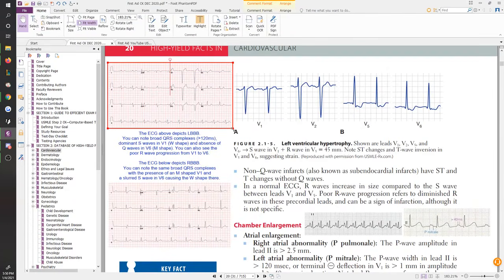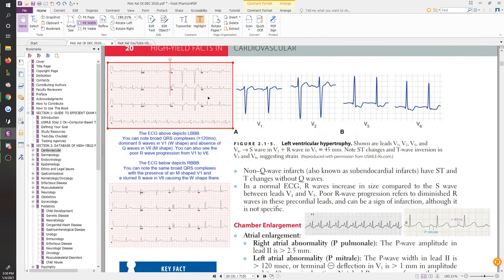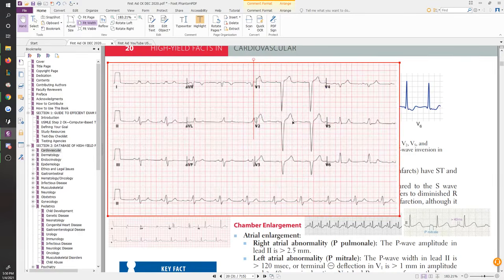In this first one up here, we actually do see some level of ST changes, but not in the V5 guy, right? So in V5, we don't really see an ST change. What we do see is that it's not as big as it's supposed to be, right? Remember that when we look at this first one, we're supposed to be thinking we have a left bundle branch block. And the reason we're immediately going to think this is a left bundle branch block is because nothing else is really wrong anywhere.